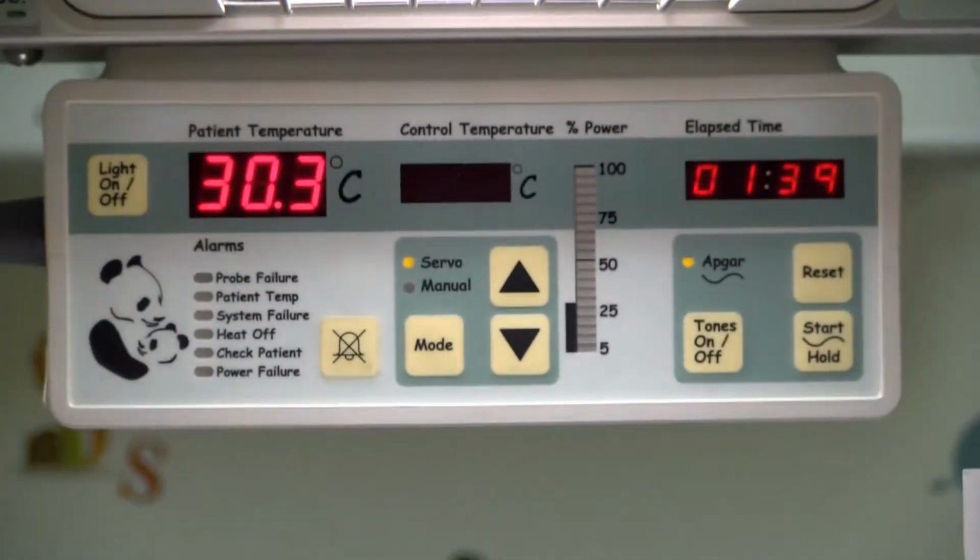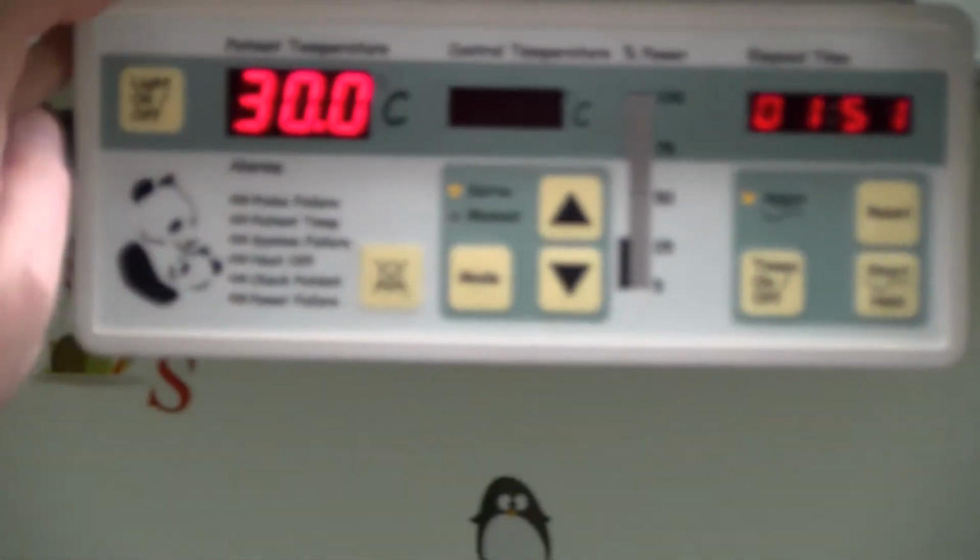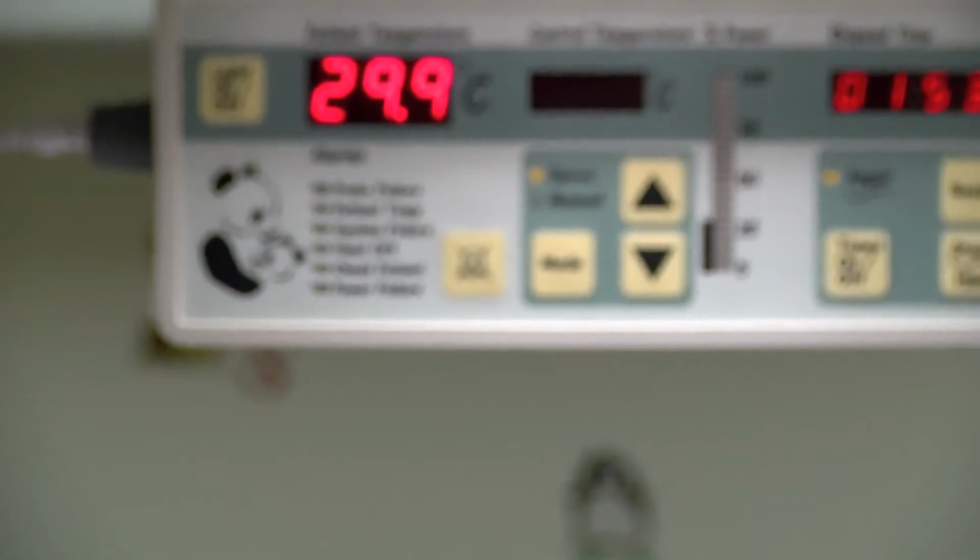It does not let me silence it because the temperature is too low. But if this patient was closer to 36 degrees, it would just be adjusting, and this would not be alarming. But since I have a doll, it's kind of hard to make the warmth.